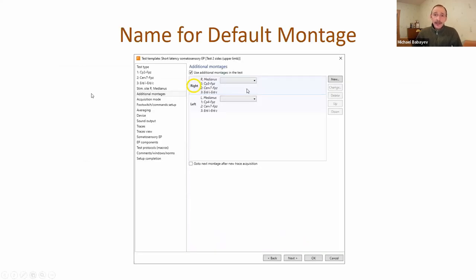Now it's possible to input a name for the default montage - a small but very useful improvement. For example, in a test template for short latency somatosensory potentials, we have two montages for right and left sides. Previously one montage was called 'default' and the other 'left.' Now it's possible to rename the default montage to 'right,' so we have clearly named right and left montages.